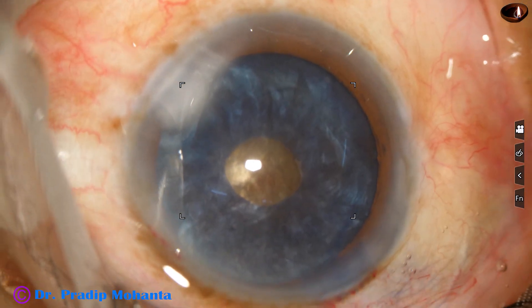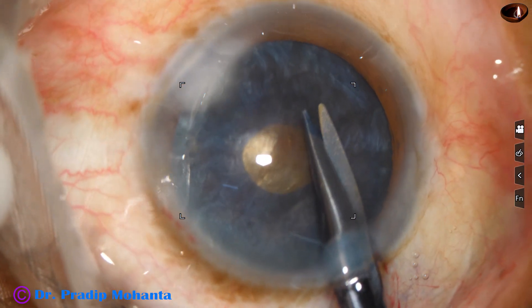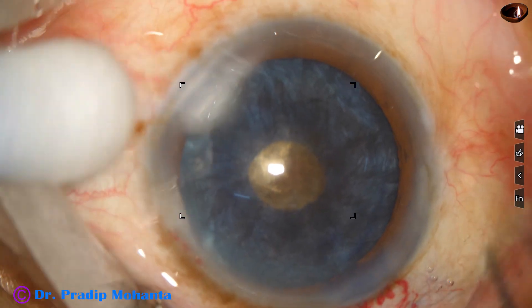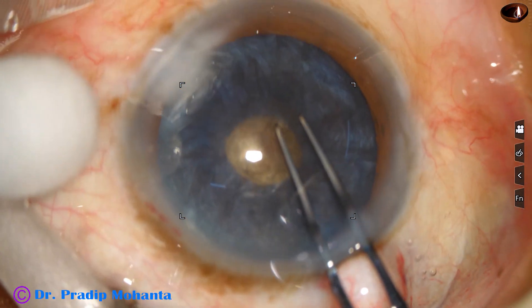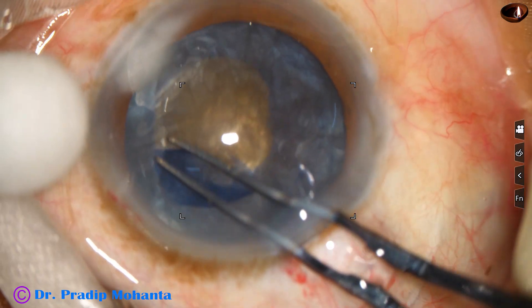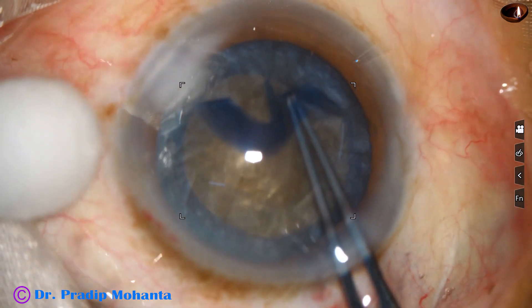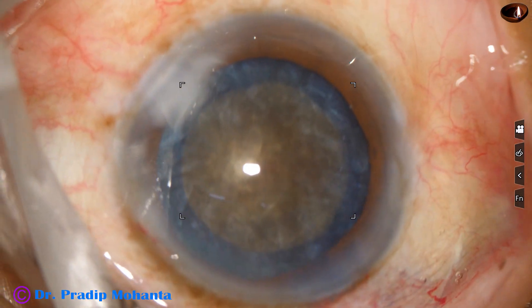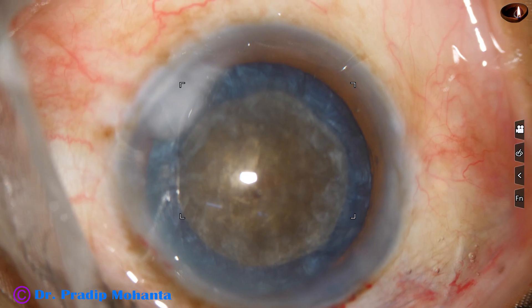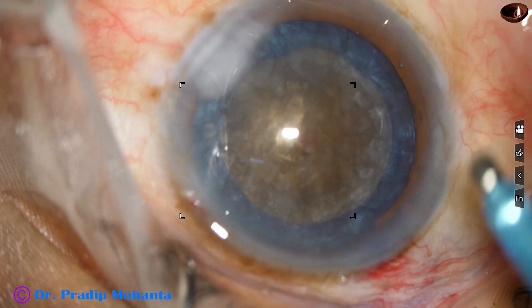We can see the nucleus. This is a very hard grade 5 nucleus sclerosis. A small cut is given at the margin of the small rexis. Utrata forceps is taken again, and the mini rexis is enlarged to an adequate sized rexis of about 5.5 mm.